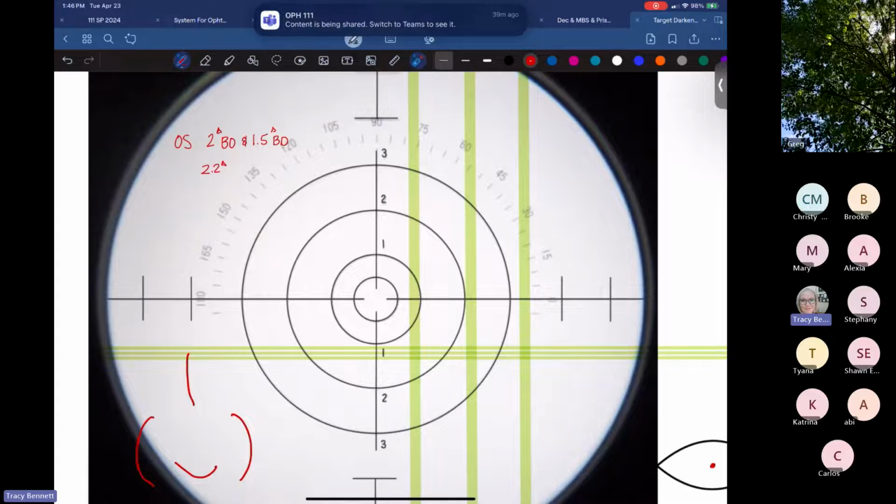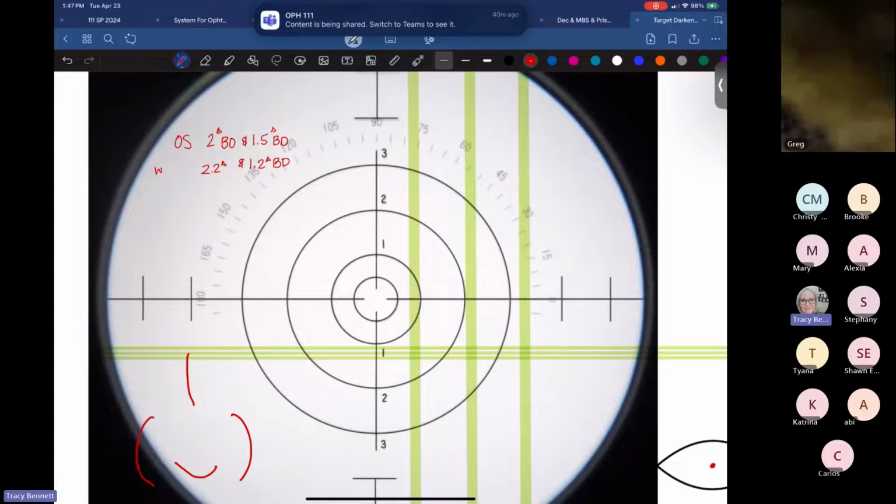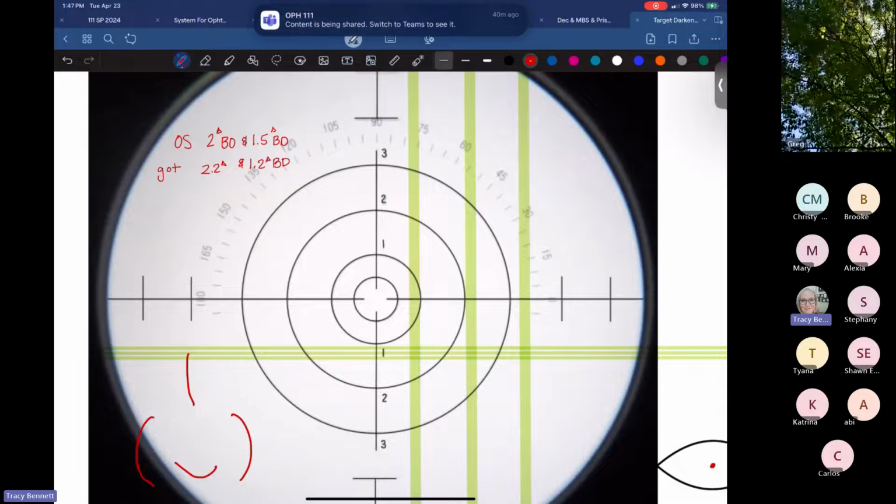And then how far down? So there's my 1, here's my 2, here's about halfway. Probably another 2.2? Or I'm sorry, 1.2. Yeah, I fell for it too, y'all. We're at the 1, just a little bit beyond. So what do you guys say, 1.2 or 1.25? Either one of those would have been perfectly fine. Base down.